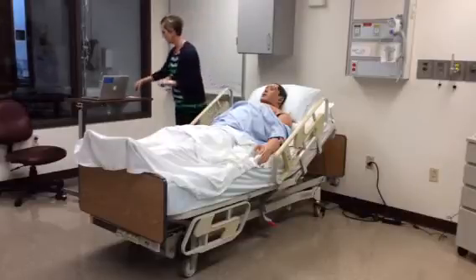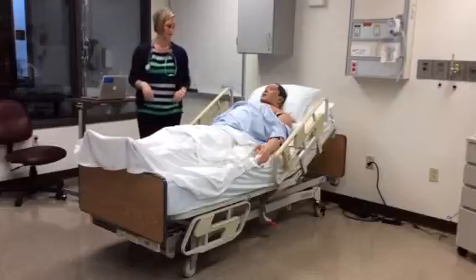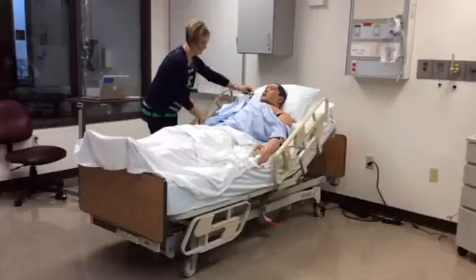Let me write that down real quick here. Now I'm going to also check your blood pressure here.